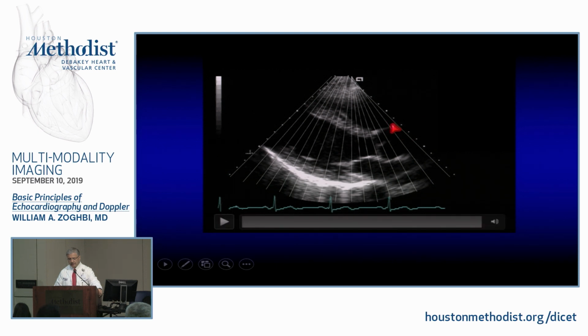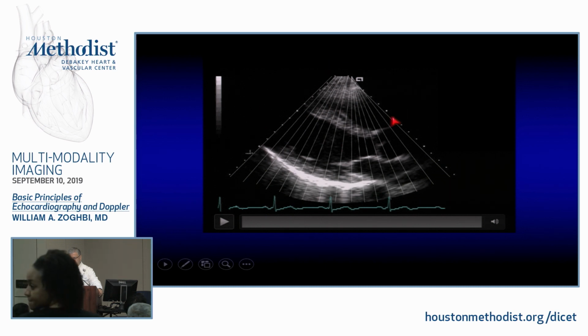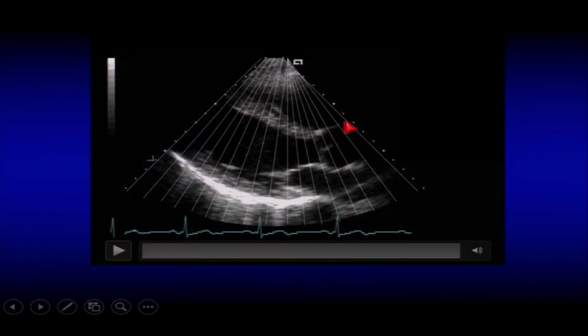So you could steer these beams from the emanating ultrasound here. Let's simplistically say the ultrasound goes down along this line, reflects off whatever is reflecting, comes back, and I register it from the same transducer up there. Then I steer it from one side to another, so I could have scan lines. I could have almost 100 plus scan lines in this sector. Here, for delineation purposes, we're spreading them apart like this.